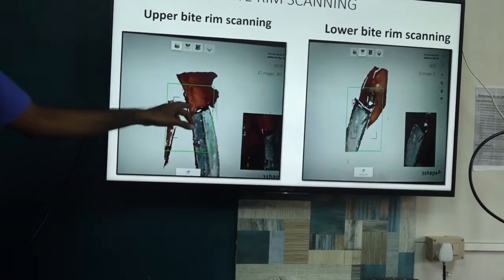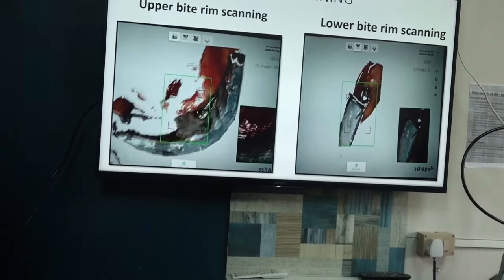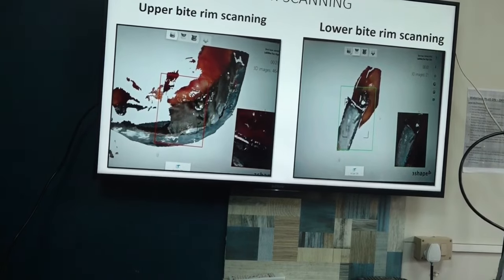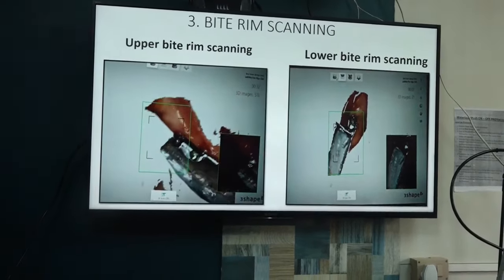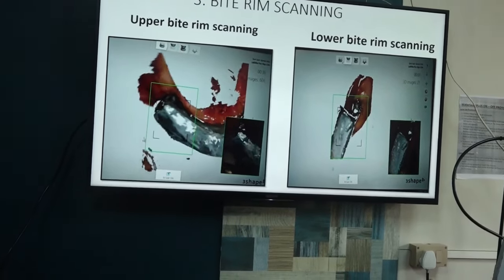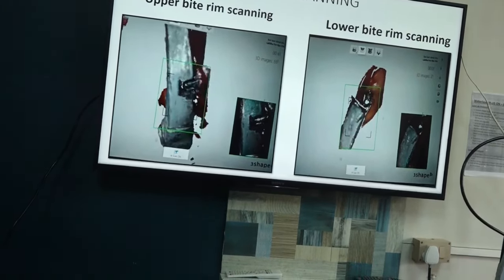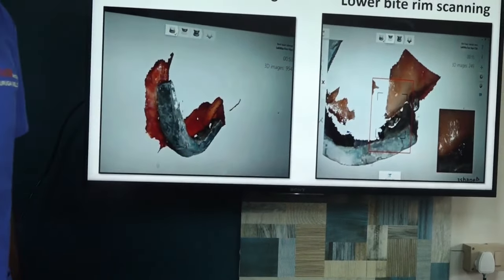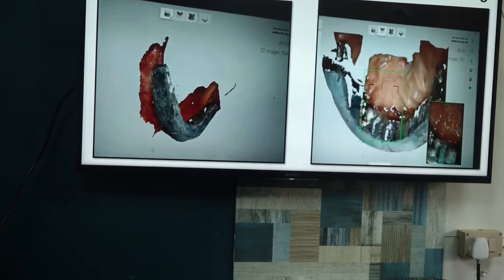And one more thing is, if there is an implant here, distally, you can completely leave it also. The margin case for implant. There is no need to cover that implant with the bite rim. Totally leaving the distalmost implant out of the bite rim. For example, upper pterygoid, there is no need to cover with bite rim. Lower, if there is some implant in the second molar region, you don't have to cover with the bite rim. See, this implant, no, it is left out of the bite rim. Upper or mid? No, this is upper.